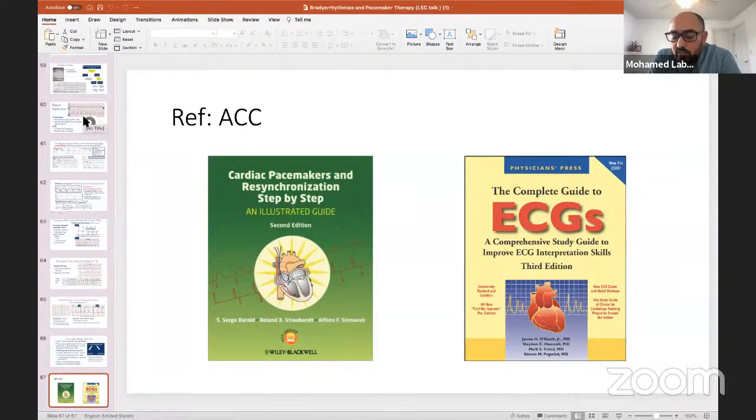If the cauterization is away from the pacemaker, rarely does it cause significant artifact on the pacemaker that causes inhibition. So I tend not to switch to asynchronous mode, even in a dependent patient with a pacemaker, if the cauterization is in the leg or something like that. The experts divide them into above umbilicus and below umbilicus, so anything in the thorax or the abdomen above, there's risk. Right. That's what I mean.